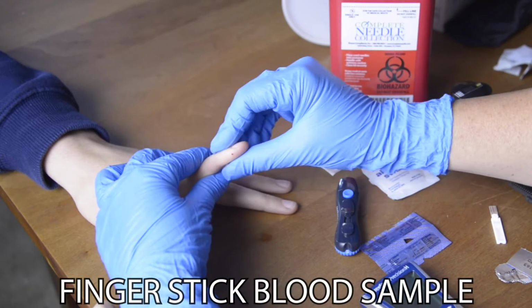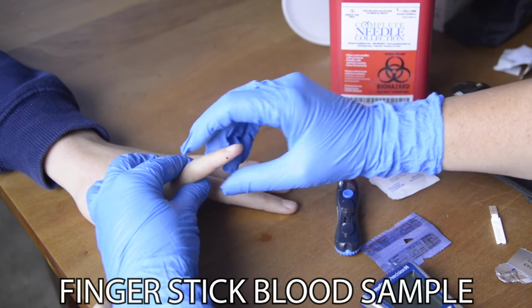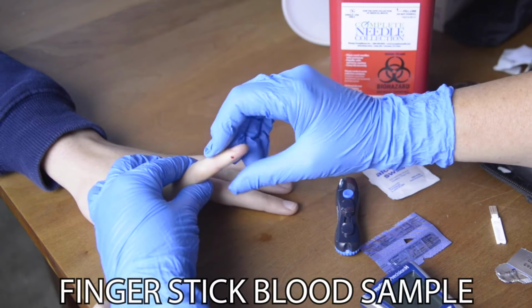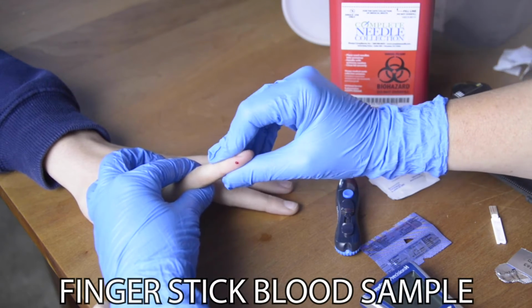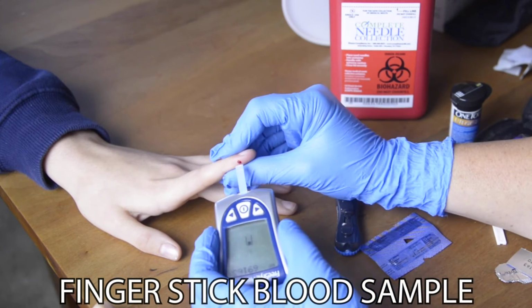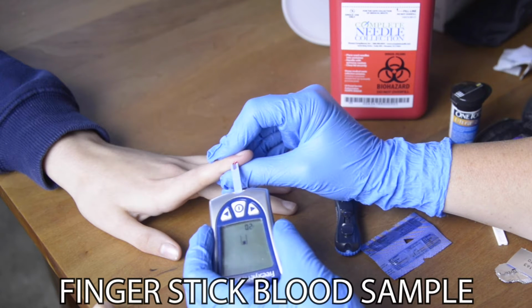Now you'll need a reasonable amount of blood to take a sample. And so if your patient's hands are cold or they're otherwise not bleeding, you want to make sure that you've got enough of a blood drop in order to be able to fill the test strip of your meter all the way up to the top.